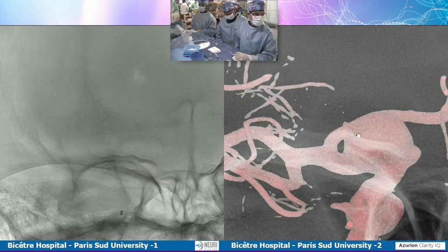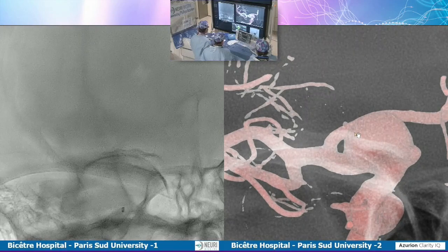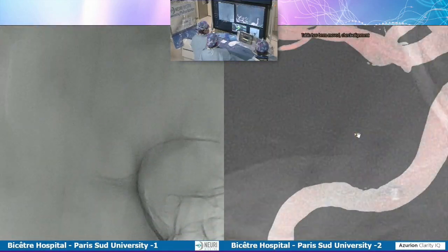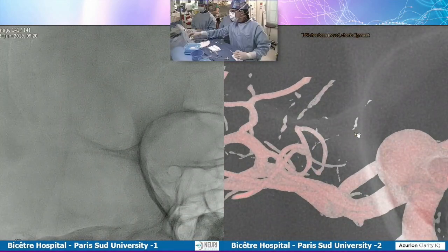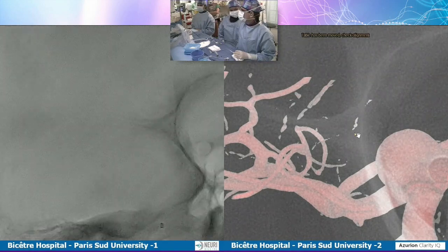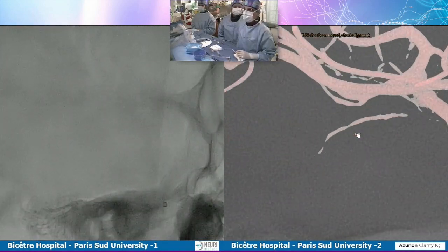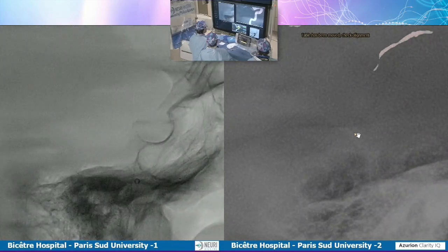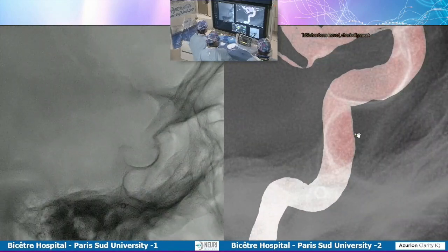I would not place coils. I think the literature on an asymptomatic aneurysm at 10 millimeters is extremely benign. So I am also not sure that 2 or 3 coils do anything for you. Maybe it helps you sleep at night better. I agree, but it's the only time you will be able to place coils in the aneurysm, after deployment of the flow diverter. It's finished.